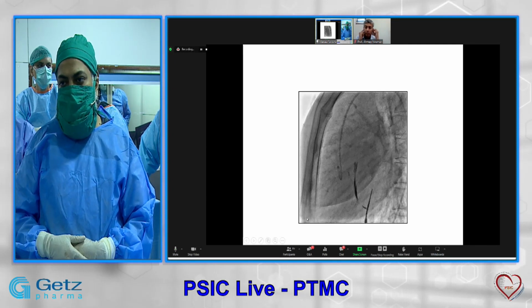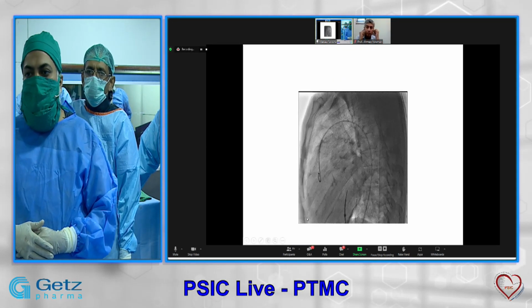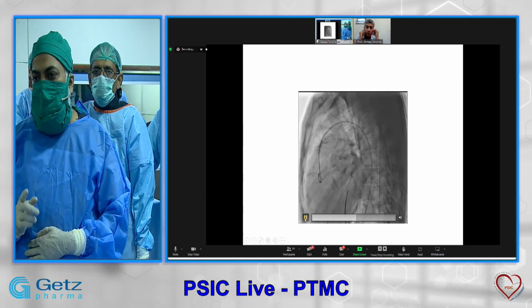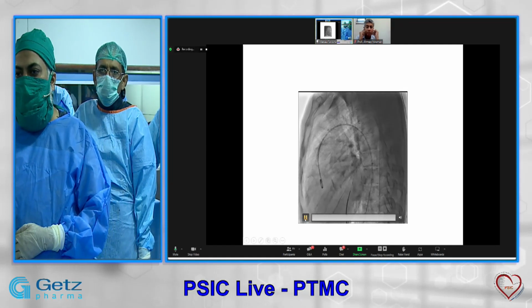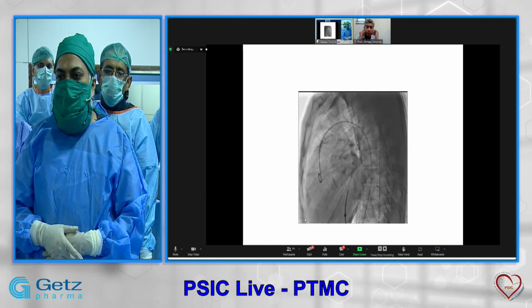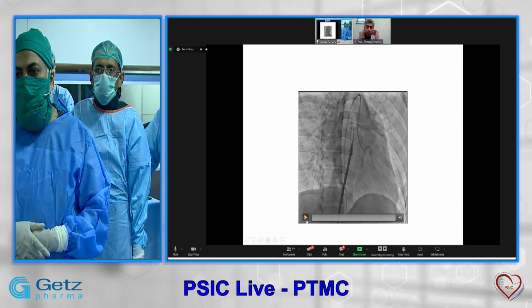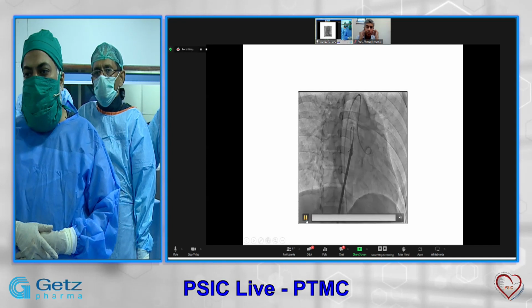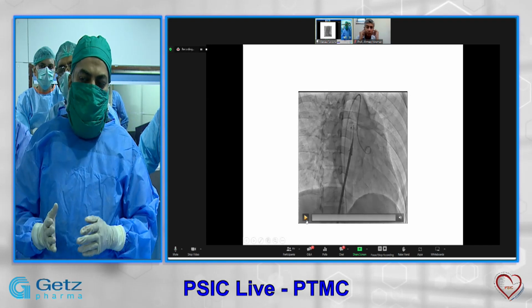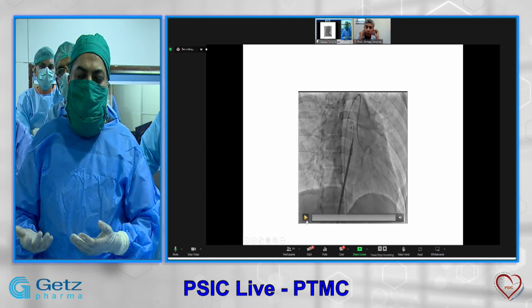Next, please. Next, please. Next, please. And redirect your needle. If you have only introduced your needle, needle punctures are most of the time self-healing, and may cause some effusion. Can you go next, please? In this patient, please run this slide. In this patient, you can see the dye is staining into the pericardium. But the operator directed the needle again into the LA, completed the procedure, and there were no complications.